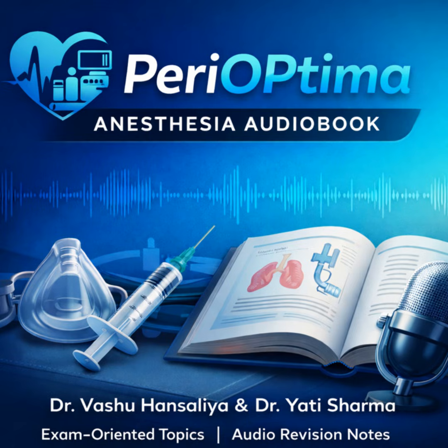Okay, moving on to the blade. This is the part that goes into the mouth. We need to be able to name its parts for the exam. And you need to understand them functionally. The main shaft is the spatula, or the tongue. Its job is to compress all that soft tissue to open up your line of sight. Then there's the flange. The flange is that vertical wall. It has two critical functions. First, it guides your endotracheal tube.